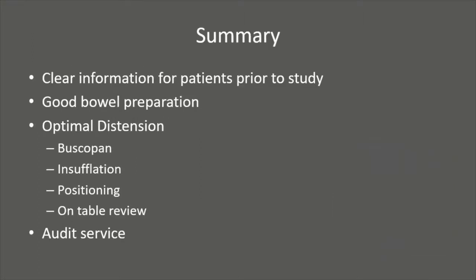So in summary, it's really important to provide clear information to your patients prior to the study, get as good bowel preparation as possible, optimally distend the bowel using below factors, and audit your service.